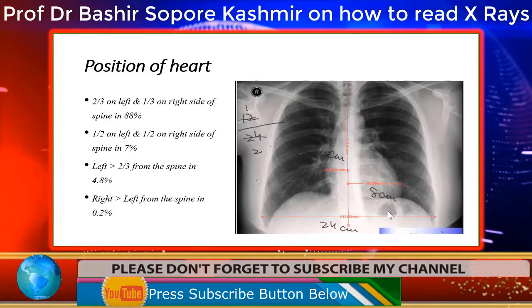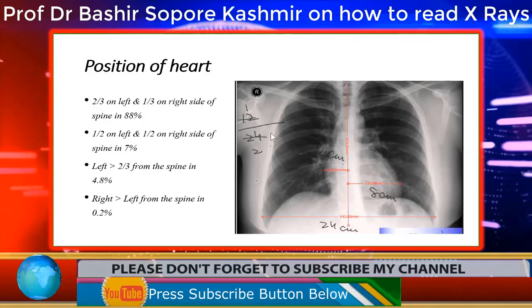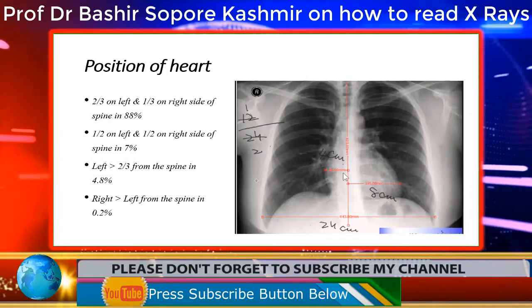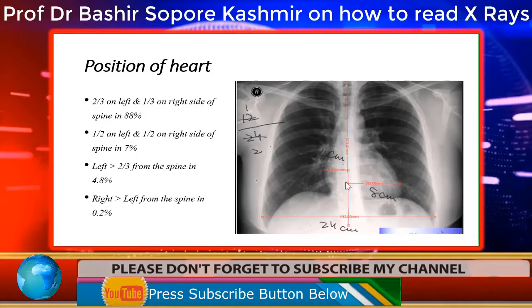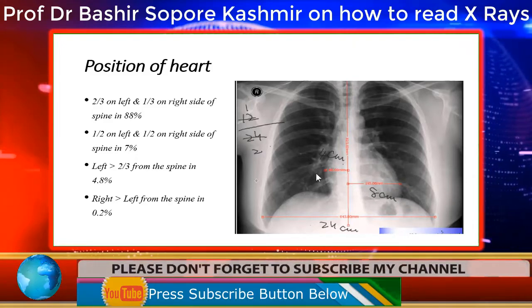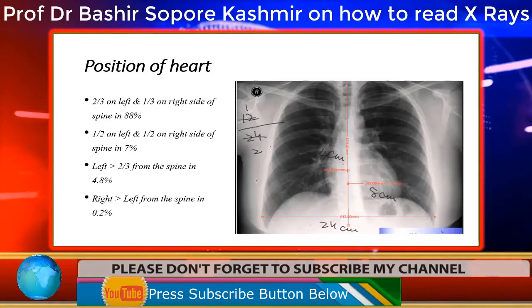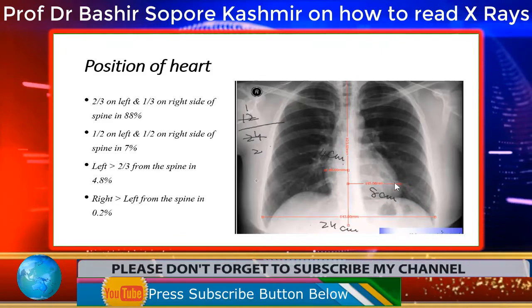So normally the cardiothoracic ratio should be less than 50%. And we see here that it is 50% here. So it is within normal limits. Now we see that two-thirds of the heart is on the left side, and one-third of the heart is on the right side. And we find this in 88% of the cases. Or sometimes we may find that half is on the left side and half is on the right side. That is seen in 7% of the cases. And sometimes the left is greater than two-thirds from the middle of the spine, but then it will be only in 4.8% of the cases.